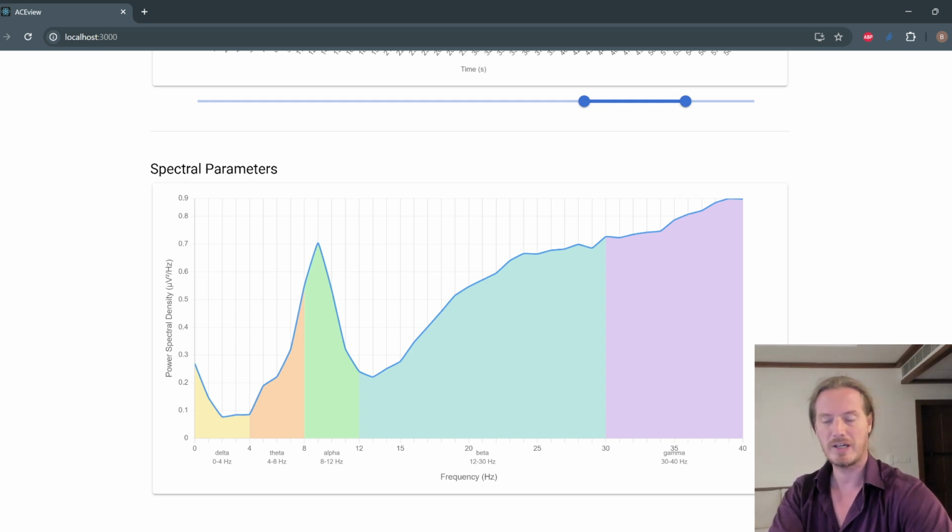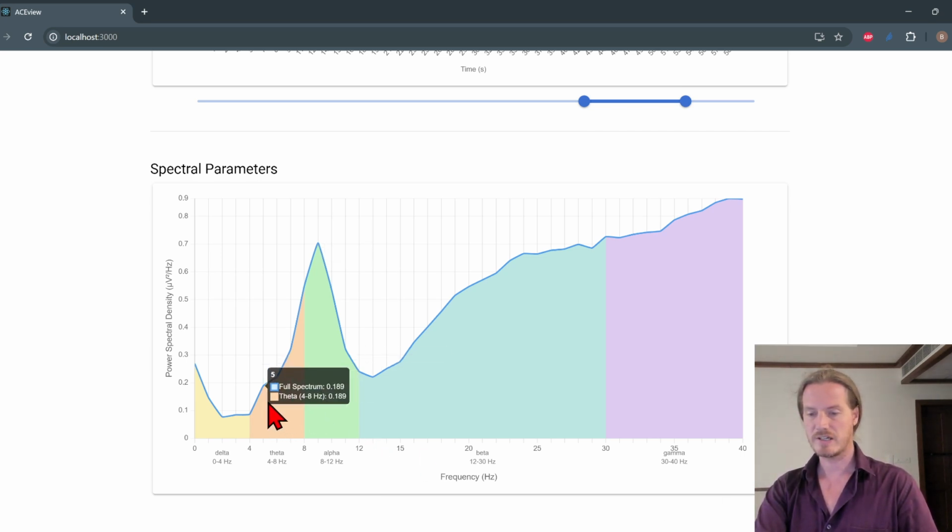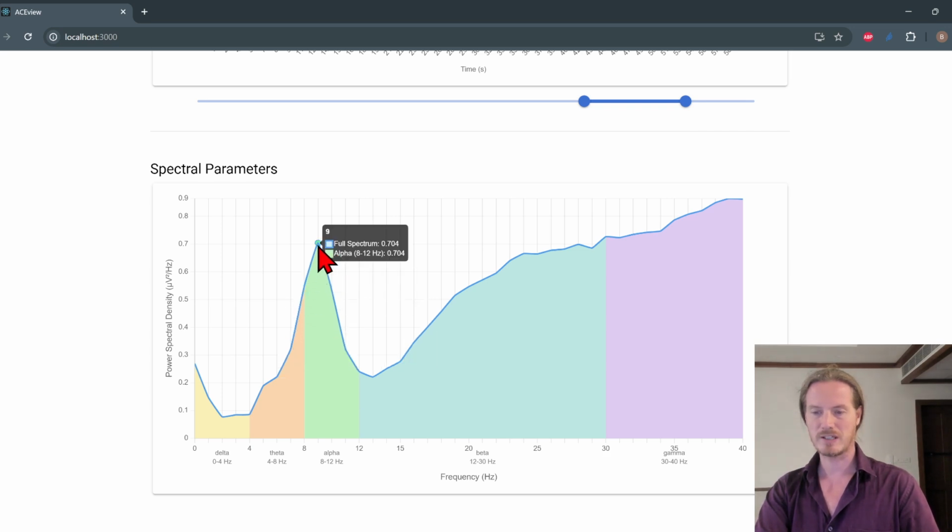And in frequency domain, instead of having time on the x-axis, we have the frequency range, and this applies over the whole recording of 10 minutes. And we can see that they had a big peak at 9 hertz specifically, not at 10 hertz or at 8 hertz or 7 hertz. They peak at 9 hertz. Other people, they might peak at 10 hertz or whatever it is.